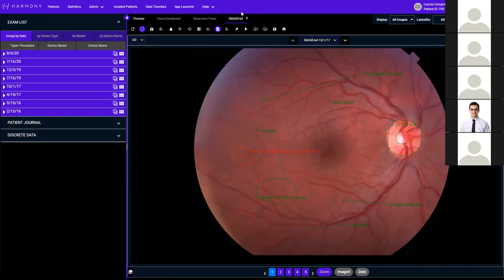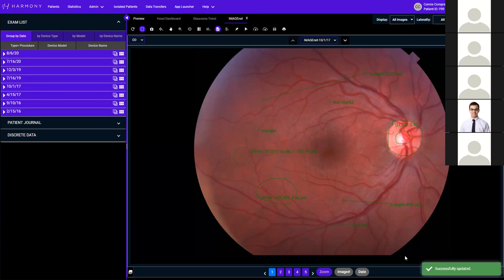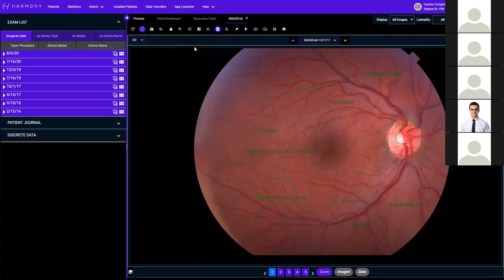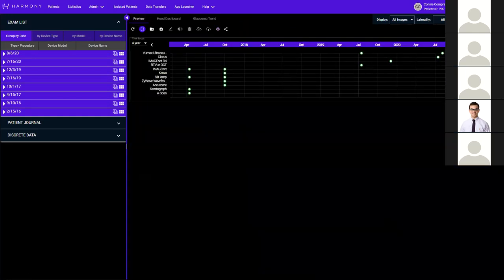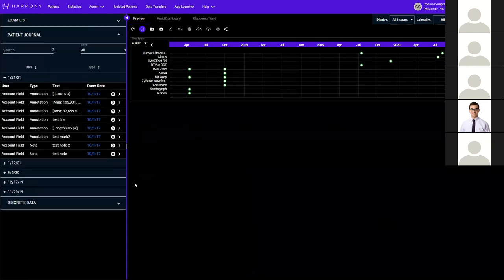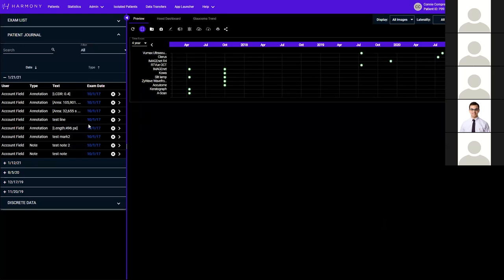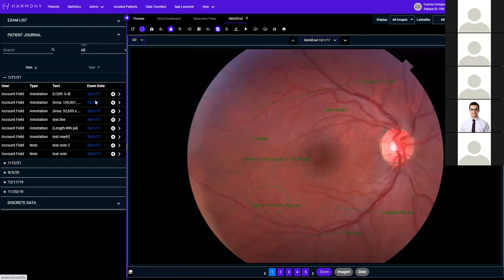Let's take a good segue to patient journal. Any kind of journal items, annotations, or notes go to patient journal. I'm going to go back to the beginning and show you how quickly you can get to it. Patient journal logs your journal items based on the date you make the note or annotation. It shows the user account, the type of journal item, and some quick preview text. These are actual hyperlinks that will take you to the exam. As I click on each one, it highlights in red which annotation is which. That gets to your question about how to delete — those X's are the delete buttons.